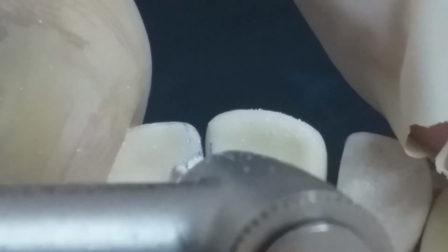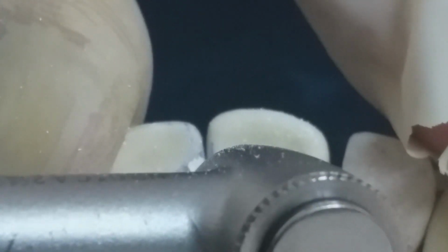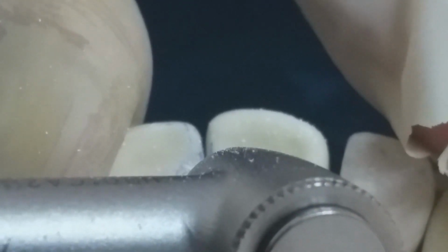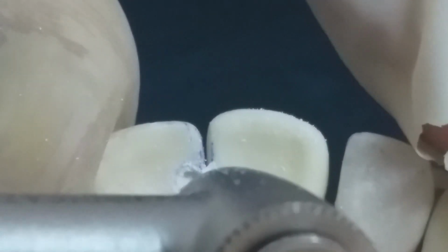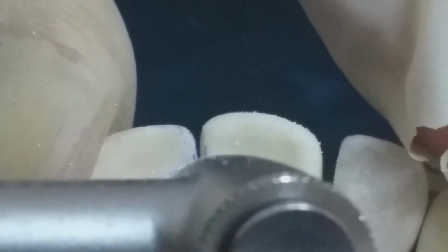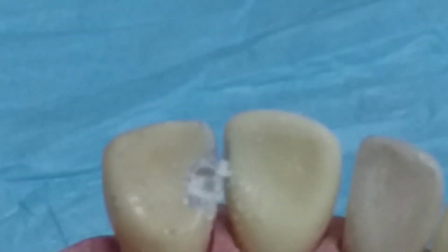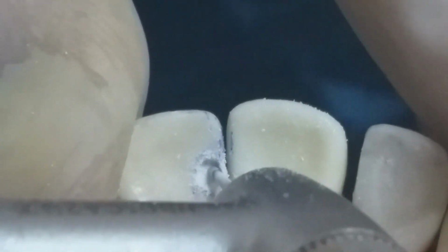We will begin to remove the shell between both teeth, like this. Continuing our removing slightly to preserve tooth structure.